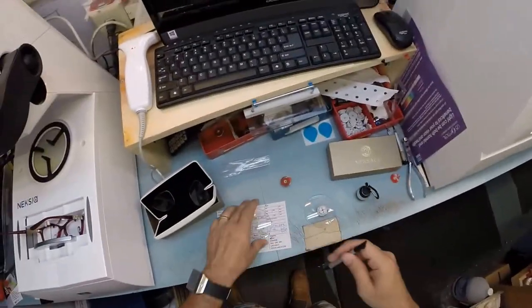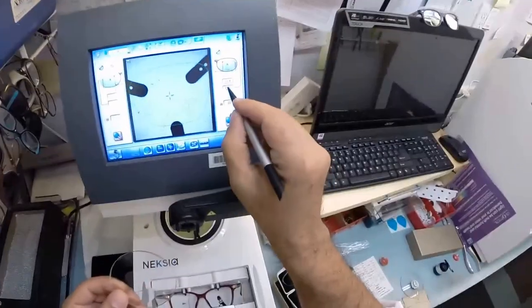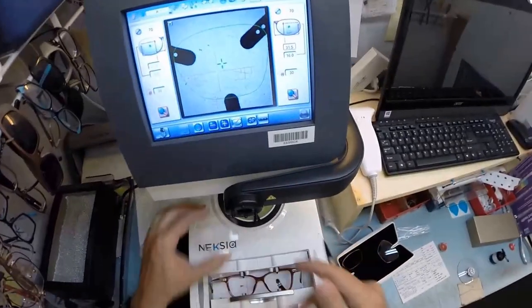We're going to do the same thing now for your left lens. Woohoo! Come here, running away, still live. I'm glad it landed this side up. So again, it mirrors over 31.5 to 16.